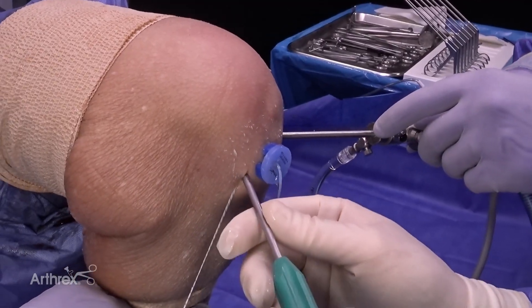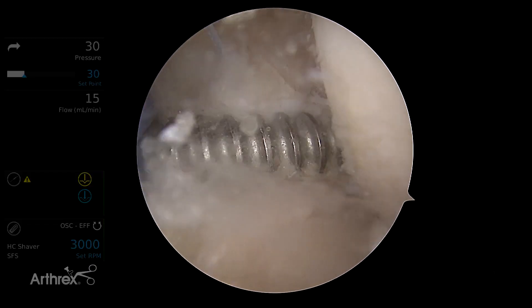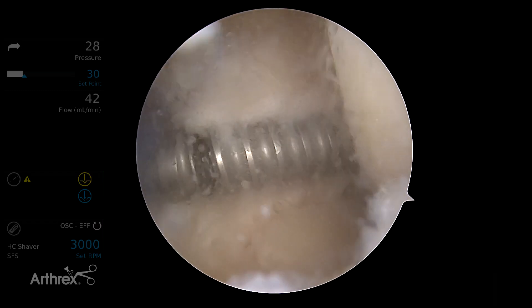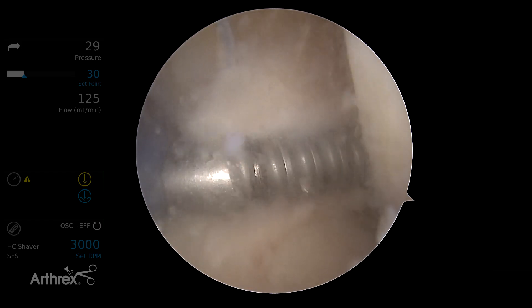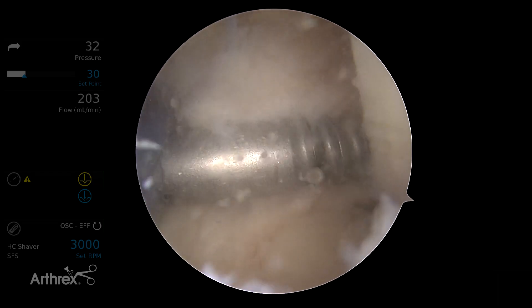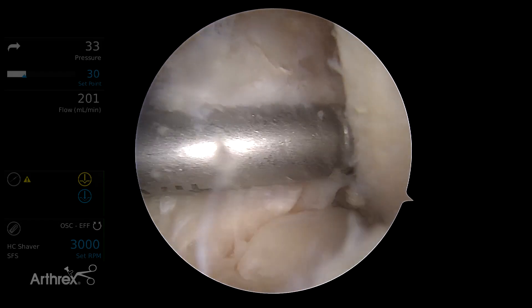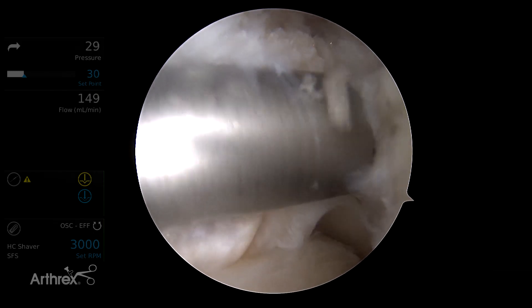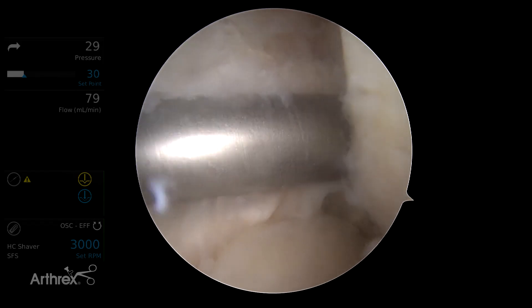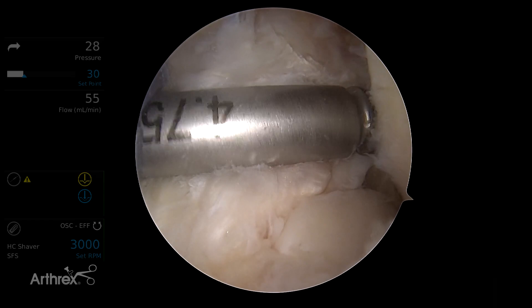Next we're going to use our 4.75 tap and go right into that drill hole to tap ourselves into the bone. It's important that you flex the knee up to 115 degrees to have the appropriate angle to enter into the wall of the femur. If you try to do it at 90, sometimes you can skive down the wall instead of getting into it. You want to bring that PL origin to you. We've bottomed out nicely.